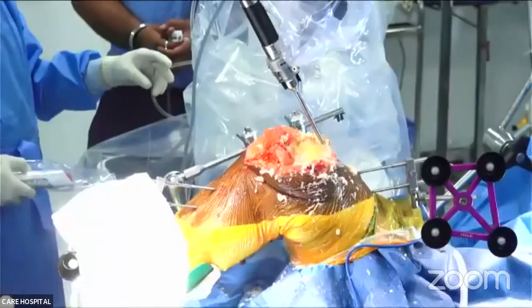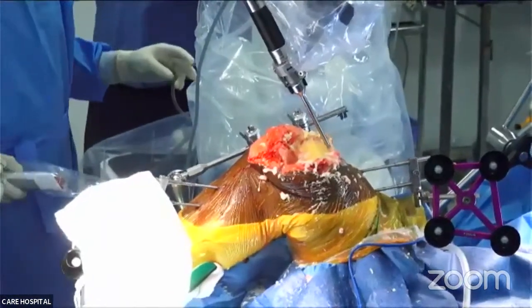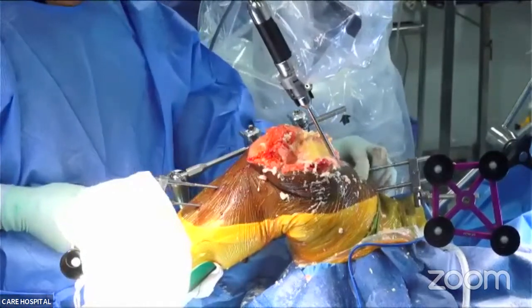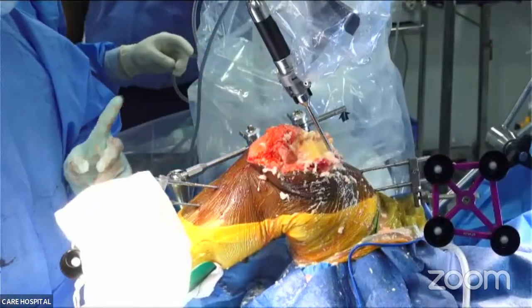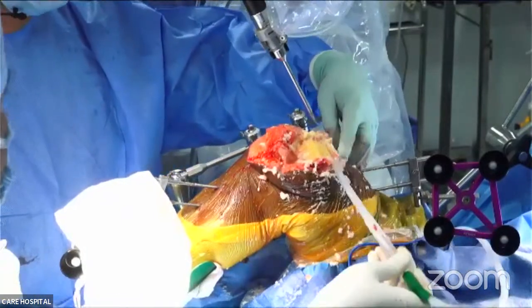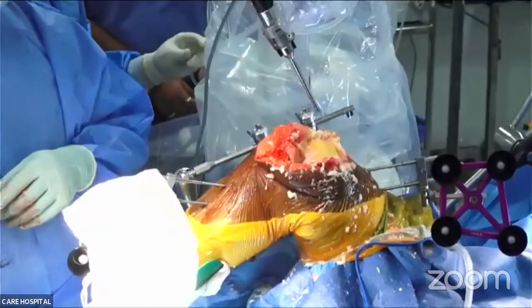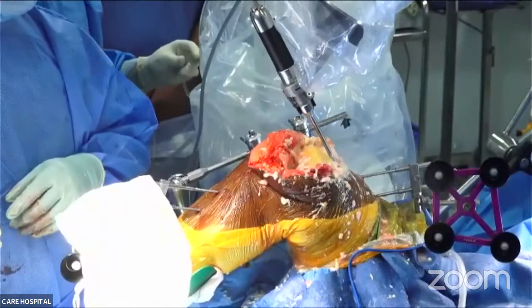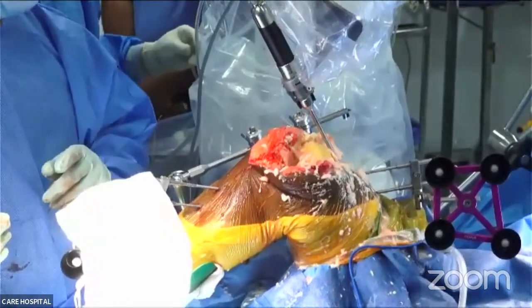There is haptic feedback. What it means is that the moment the burr is outside, not touching the bone, it will stop. So we had marked the points and it will stop just before those points. So there will be an outer rim of bone which will be left, and that has to be removed with a nibbler. The robot leaves it purposefully so that it doesn't invade the soft tissues. Okay, start. Stop. Go to the next cut.